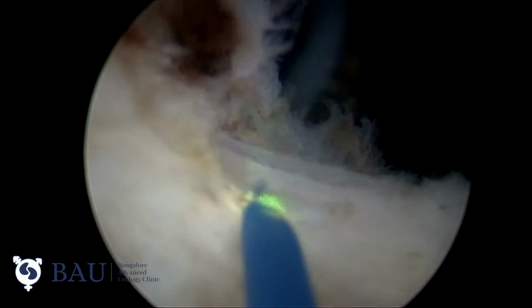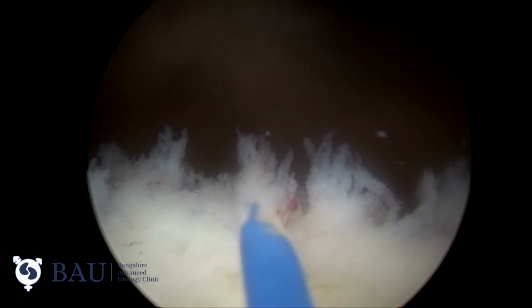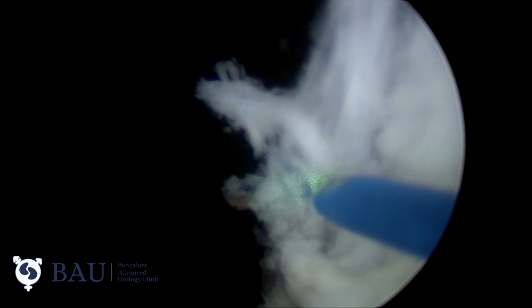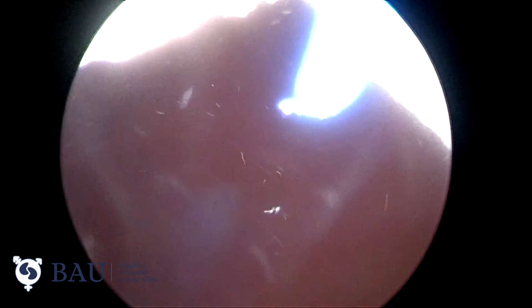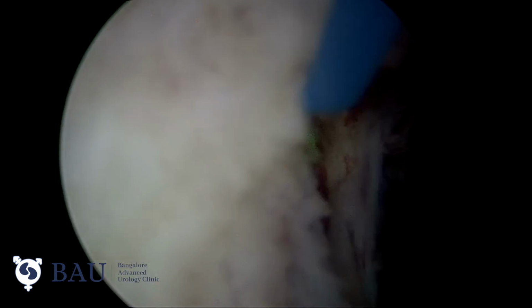We have to spend adequate time in achieving perfect hemostasis. Major bleeders will be in the bladder neck. These mucosal bleeders are the most important bleeders during our morcellation. So we have to achieve as much hemostasis as possible by coagulating these mucosal bleeders so that we can get a clear field during morcellation. These are all mucosal bleeders which trouble later.